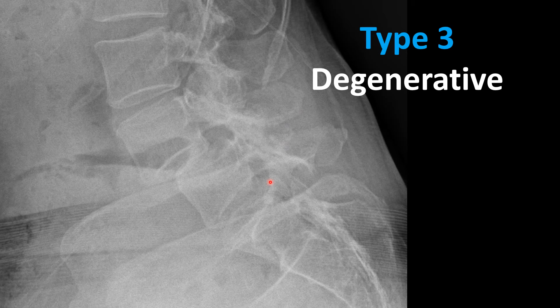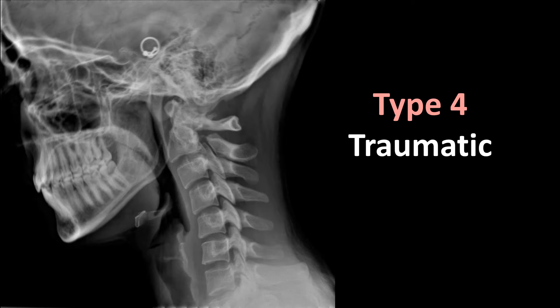Type 4 spondylolisthesis is due to a traumatic etiology. While you might think this would be common, it is actually extremely rare. In the cervical spine at C2 — referred to as a hangman's fracture — it is the most common location and is a very severe medical emergency. On this image we can see a bilateral pedicle fracture of C2 causing a slight anterolisthesis of C2 in relation to C3.